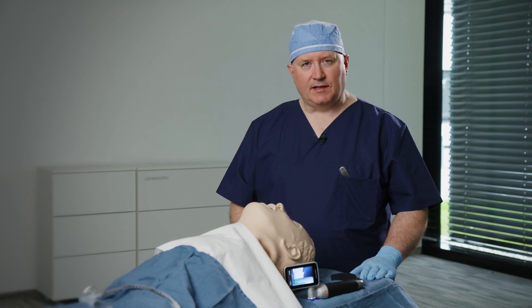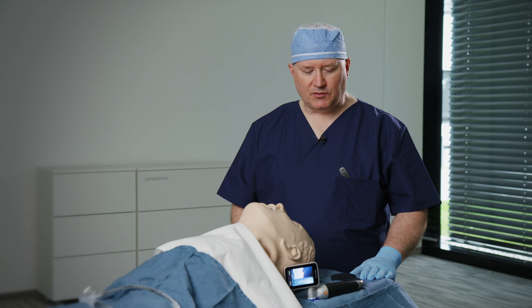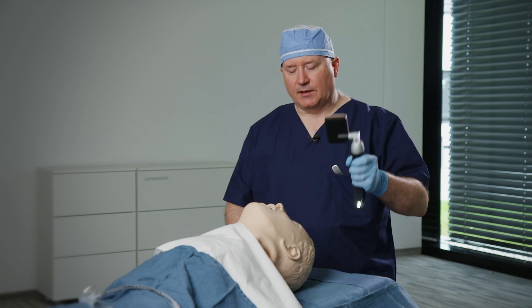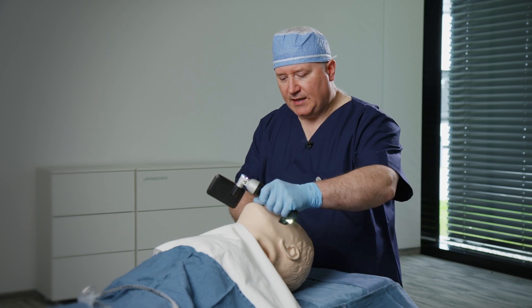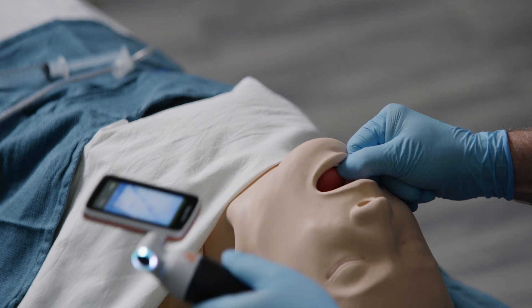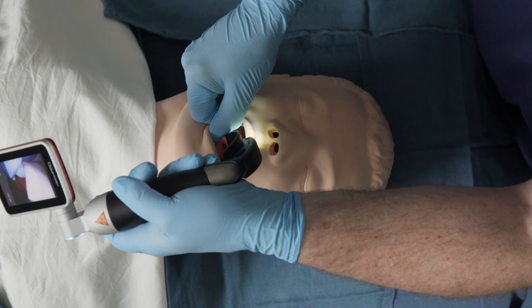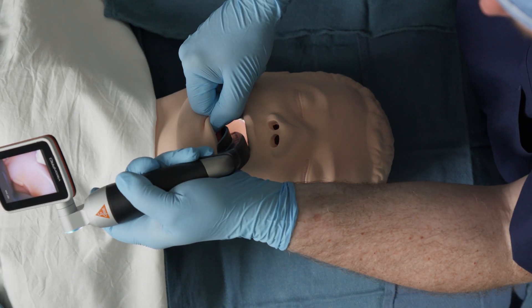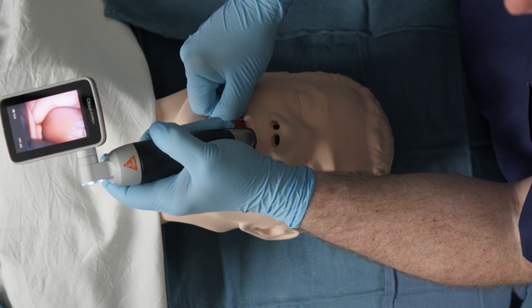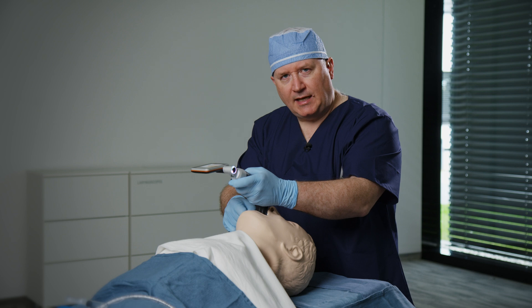I'm going to be demonstrating the technique of tracheal intubation using a styleted tracheal tube with our video laryngoscope. I'll begin with holding the laryngoscope in my left hand, pushing on the mentum, and then performing something known as a scissor maneuver with my right hand. I'll then place the laryngoscope coming in from the right side of the tongue, so I can use the flange of the Macintosh-shaped blade to contain the tongue.